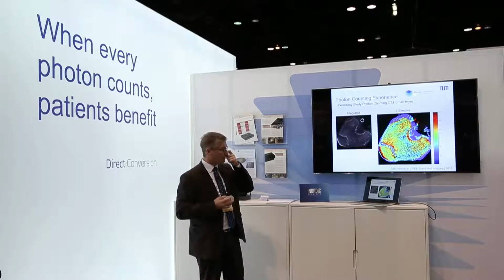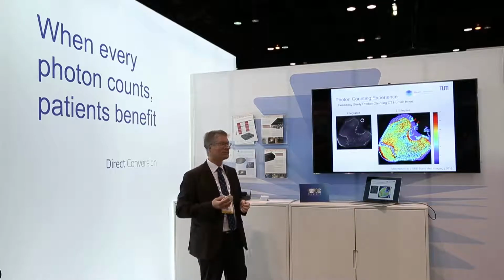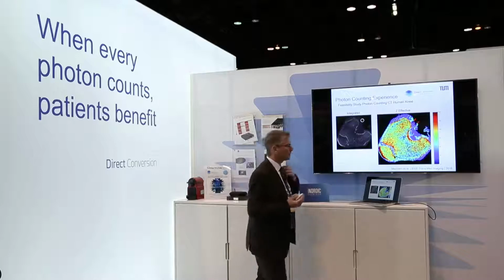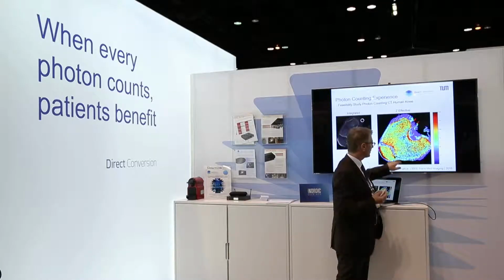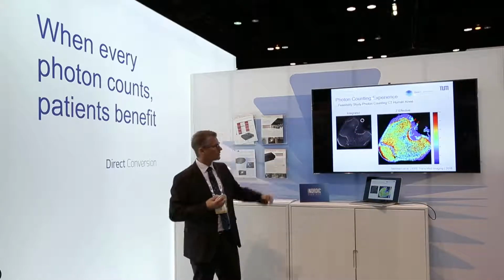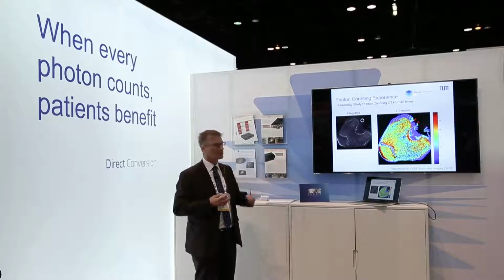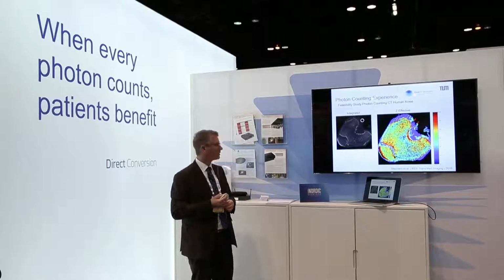Or you can also calculate this effective Z map that I showed you before, which gives you now access directly to the average atomic number that is present in the different energy bins, or different parts of the image. That was actually reconstructed with a dictionary-denoised model-based iterative CT reconstruction, which is actually state-of-the-art.